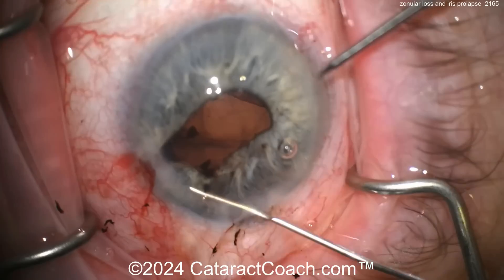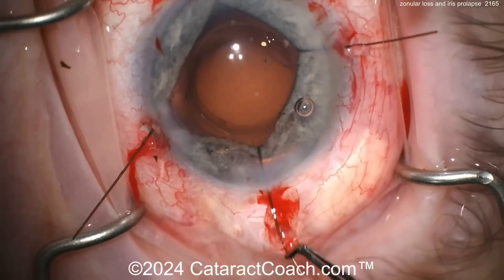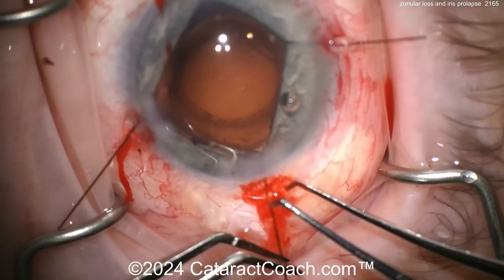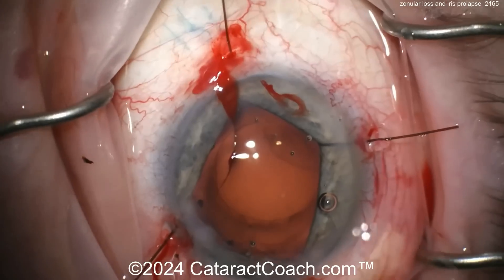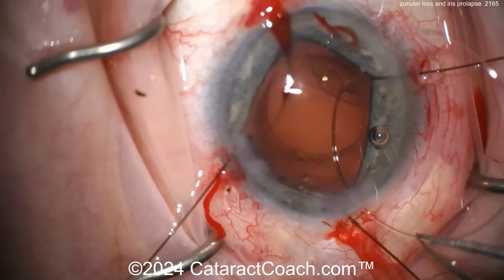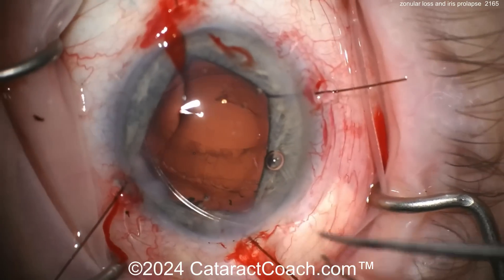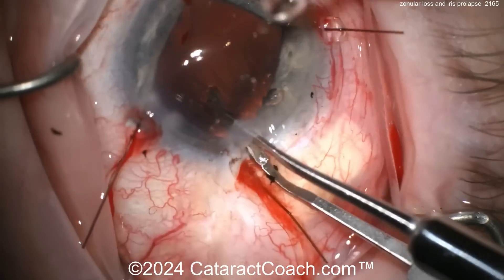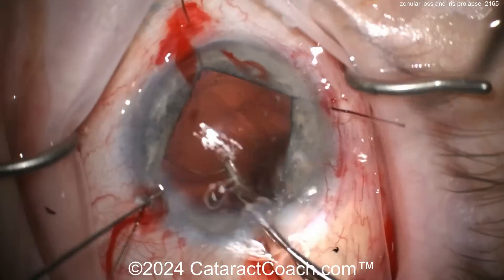The rhexis looks pretty good actually. Remember, sometimes you've got viscoelastic in the eye and the rhexis can look great — beautifully centered because it's full of viscoelastic. Here comes a CTR — a little manual two-handed insertion. That should do okay. Bring that around and get that in the bag and drop it into place.